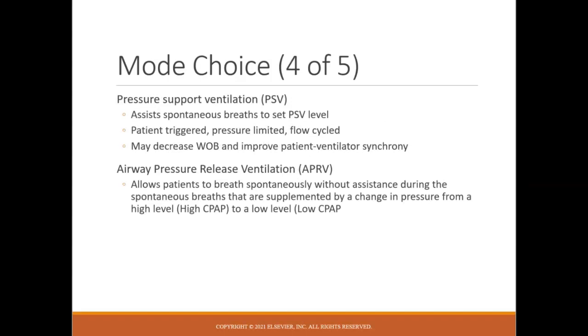Pressure support ventilation, again, recapping, is assisted spontaneous breaths. So the patient has to initiate and end the breaths through their effort. All we're doing in pressure support ventilation is giving them a little bit of boost. We're just giving them a little bit of pressure, just like they would get on BiPAP, to help them achieve good spontaneous tidal volumes and reduce their work of breathing, especially when you think about the fact that they are intubated, they have to suck through that straw of an ET tube. So giving that little bit of pressure support will help with that.